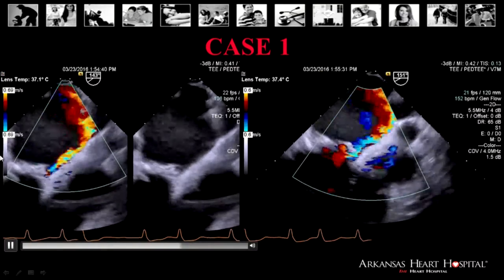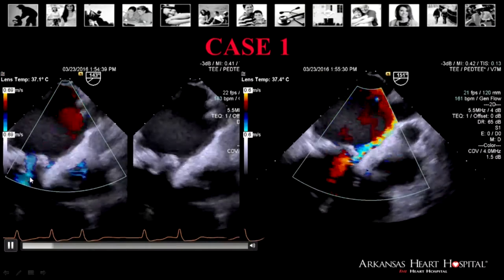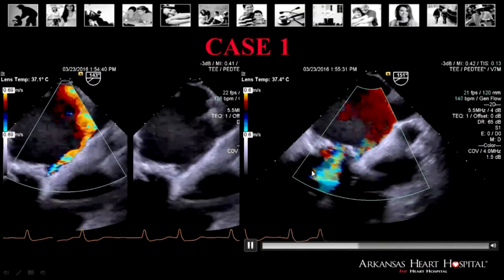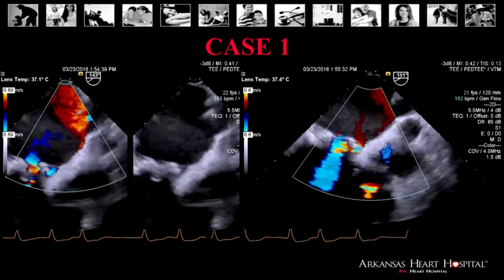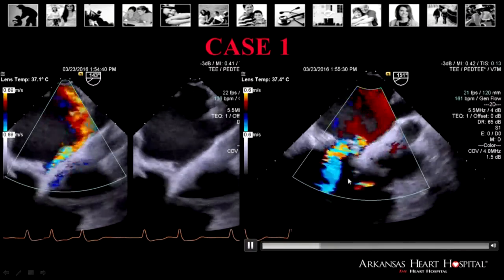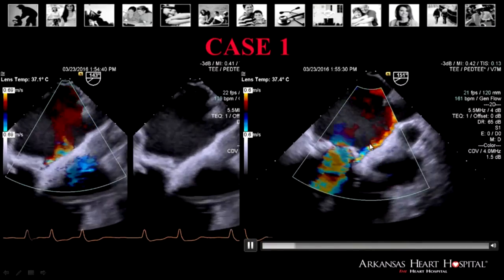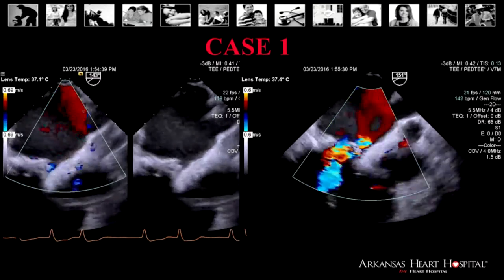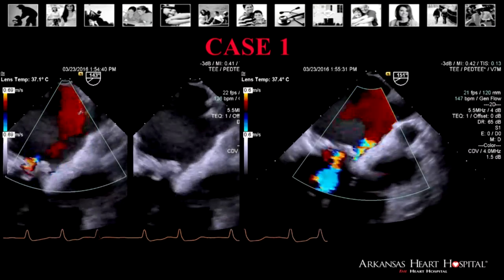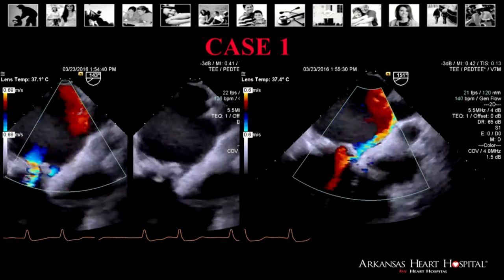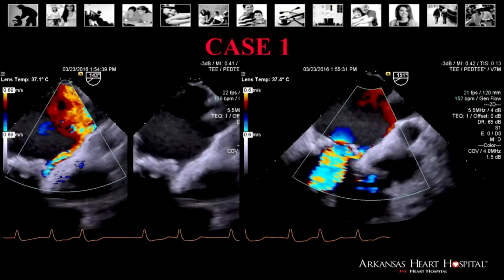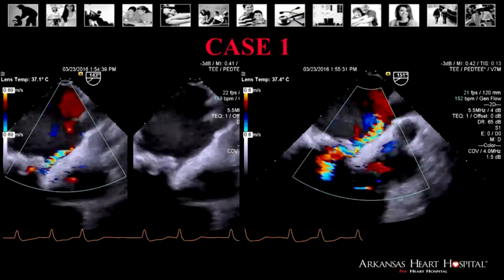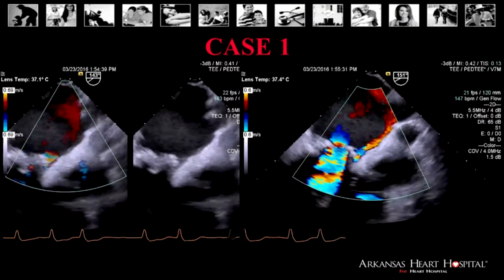The next images show different views. We've rotated the camera and can see this is close to the aorta, and these leaks tend to have a different track — this one looks like a snake-like progression going from the valve and tracking around. This lady was very difficult to image; because of her small habitus and small size, we could only fit a pediatric probe. You'll see in the second case how much better quality imaging we get with a 3D probe. We were still able to get adequate imaging and plan pre-procedure how we would close this.